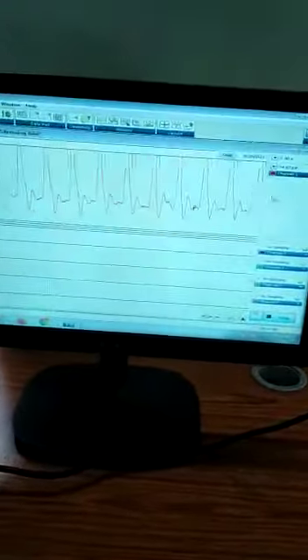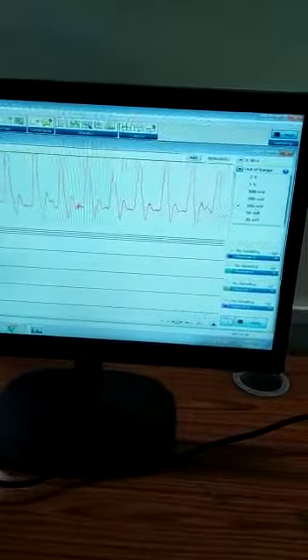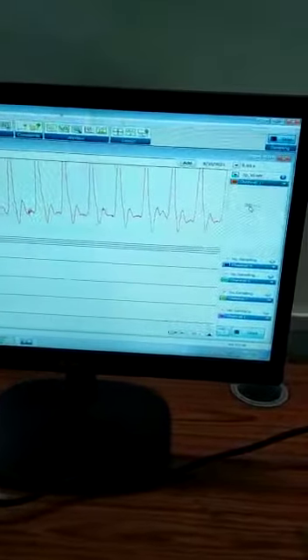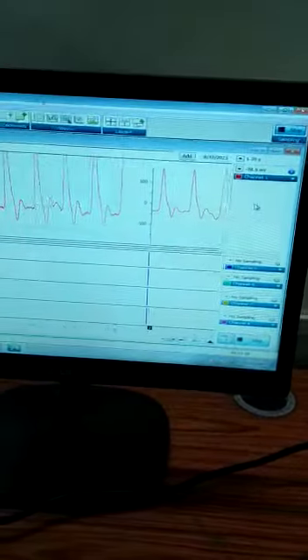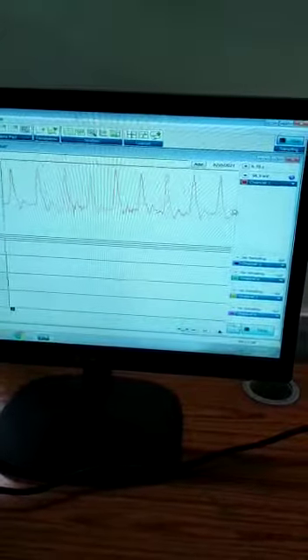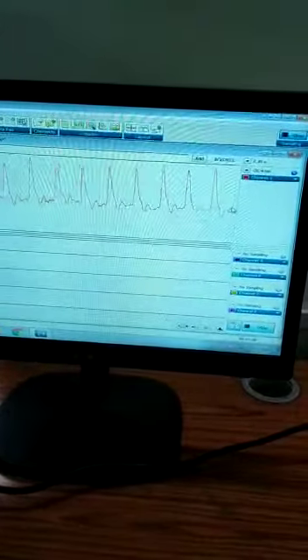The signal is amplified. Amplification is possible by using these millivolt settings. You can set the millivolt settings and choose how much amplification you want.